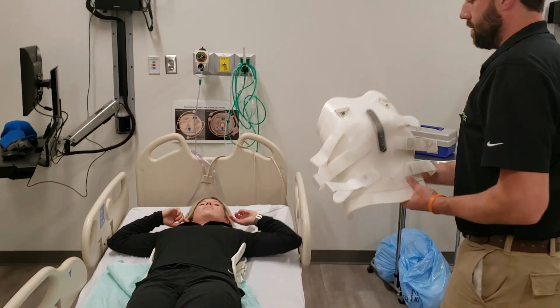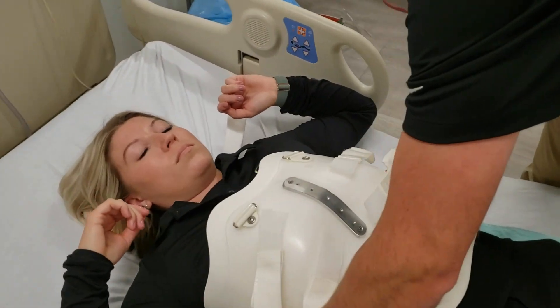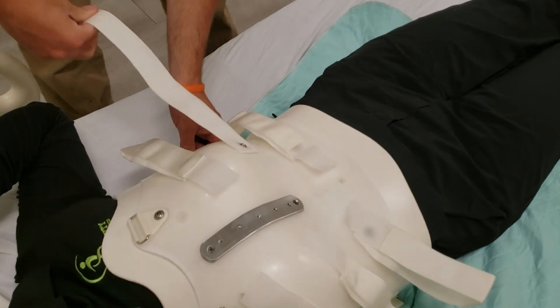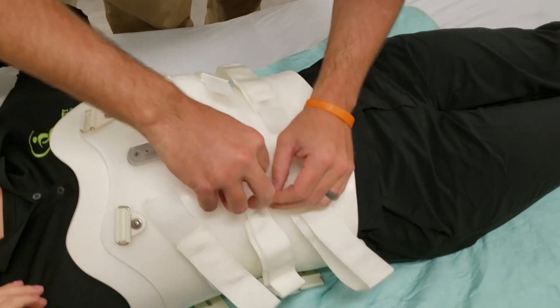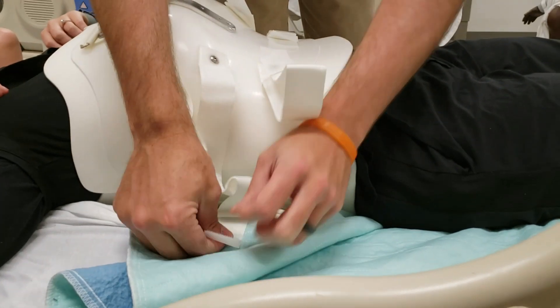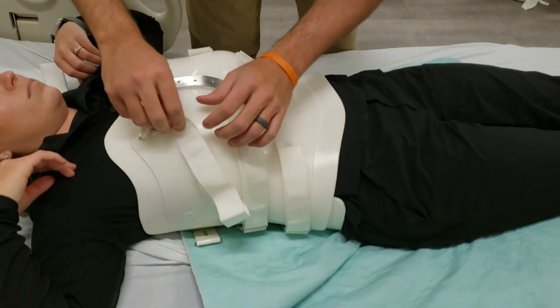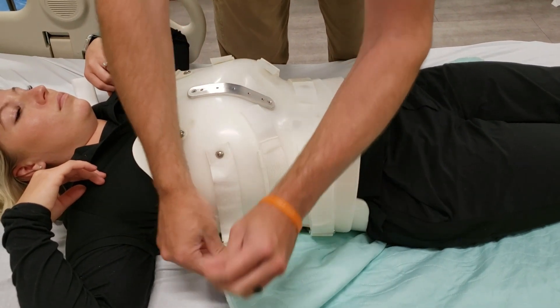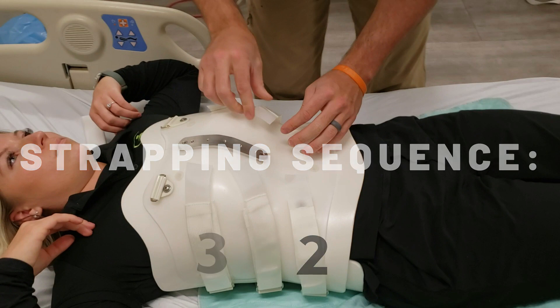After the posterior panel is on, you'll line up the anterior section and attach each strap that lines up together. I always begin by loosely attaching these straps and then going back up and cinching them up afterwards.